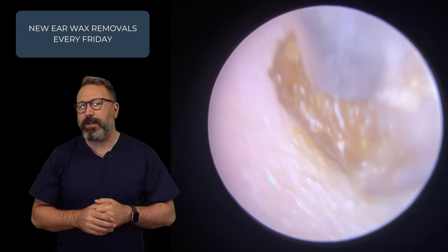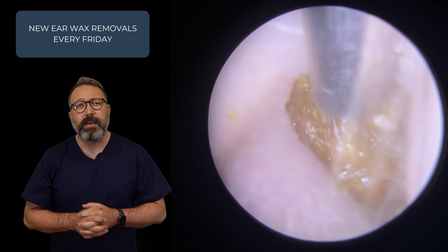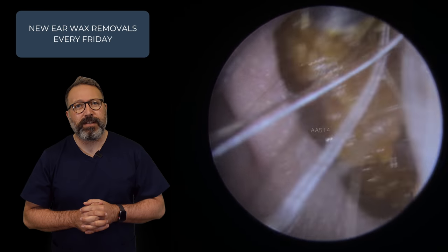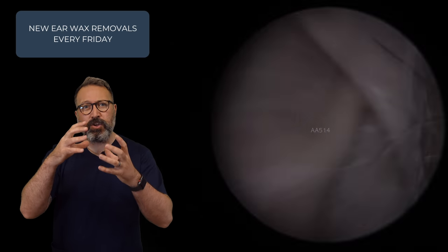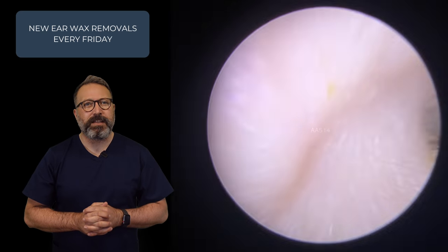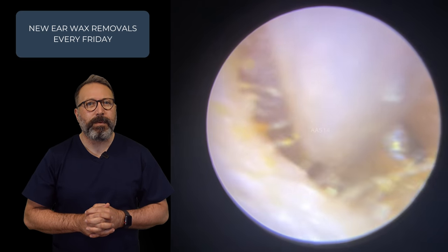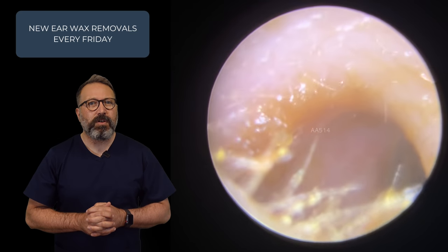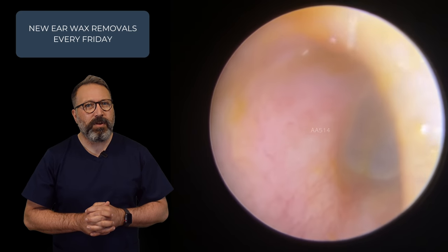You can see this little sticky bit now coming away — we're drawing that deeper section down the ear canal. There we are, a lovely long piece of wax. And there's another little bit that's been brought forward. The nice thing with sticky wax is that it does tend to bring the next section forwards. And that last good-sized chunk — look at that coming away, a really good-sized piece of wax. Just left a little bit of stickiness behind, so we'll hoover that bit up. That's all gone.